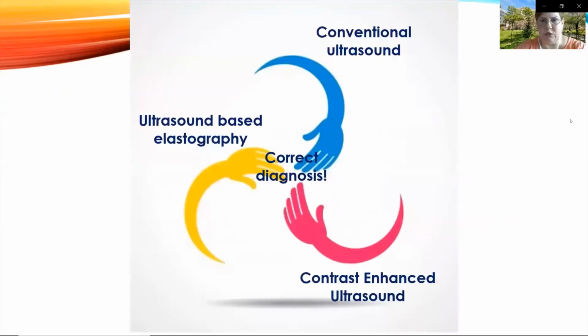I hope I was able to convince you that conventional ultrasound, together with the other features that are available in multiparametric ultrasound, like ultrasound-based elastography or contrast-enhanced ultrasound, can give you more information that can lead you to a correct diagnosis.